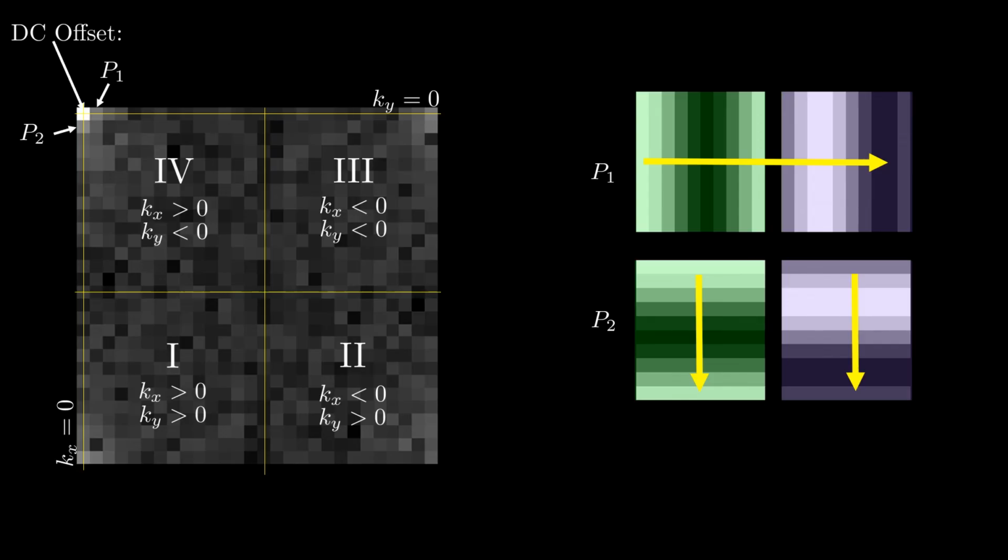So there you have it. A quick, yes, that was quick, intro to Fourier theory in kSpace. So where are we going with this? Well, in fact, an MRI scanner collects its data in kSpace. As a quick teaser for our next adventure, consider a 2D distribution of spins following excitation by an RF pulse into the rotating frame. So the z-axis here is coming out of the screen.